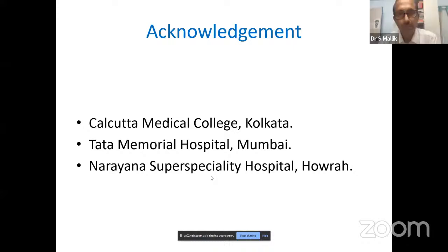What should be the lower border for the lateral fields in phase 3 in case of carcinoma oropharynx? For lower border, that depends on your nodal involvement. If it's a node negative tumor, you may consider not treating contralateral level 4. You can reduce the lower border up to the lower border of the cricoid cartilage.